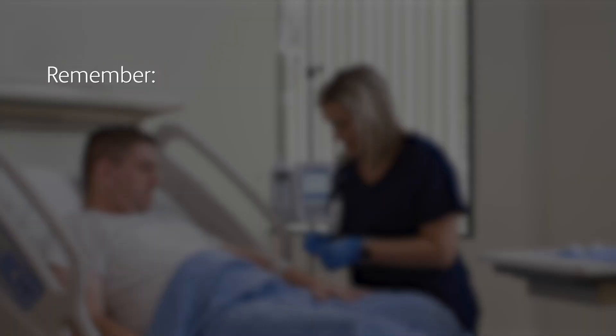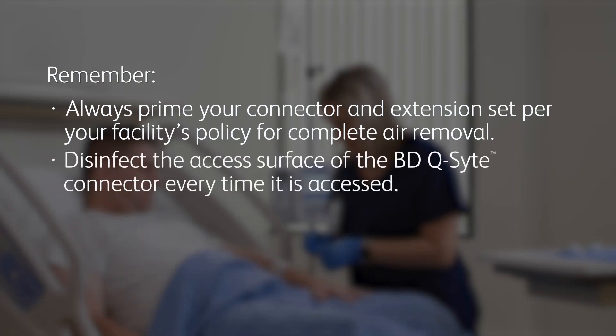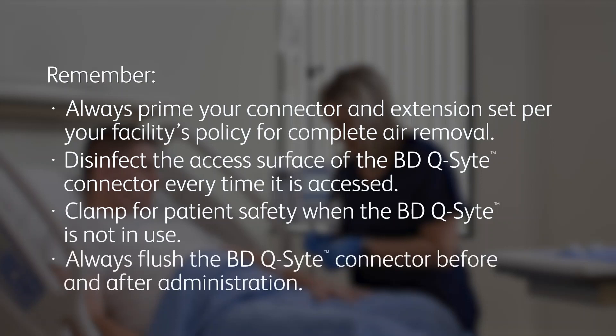Please remember the following items as you consider incorporating the BD Q-Site into your practice: Always prime your connector and extension set per your facility's policy for complete air removal. Disinfect the access surface of the BD Q-Site connector every time it is accessed. Clamp for patient safety when the BD Q-Site is not in use. Always flush the BD Q-Site connector and catheter before and after administration. Flushing before administration helps ensure the catheter is patent prior to delivering medication. Flushing after administration helps deliver the required medication dose and helps maintain catheter patency.